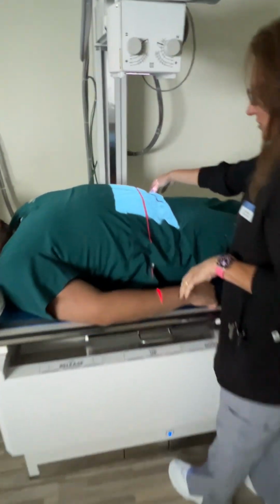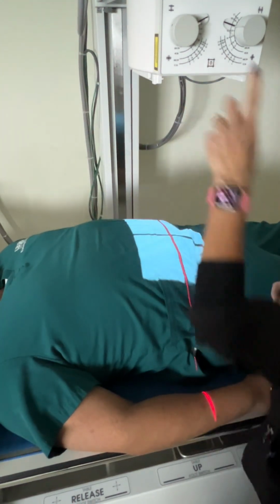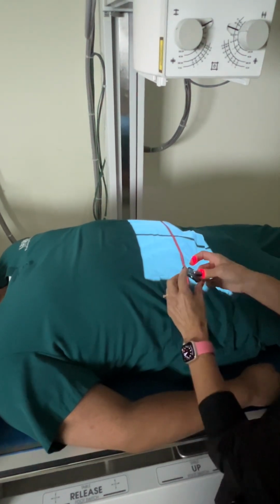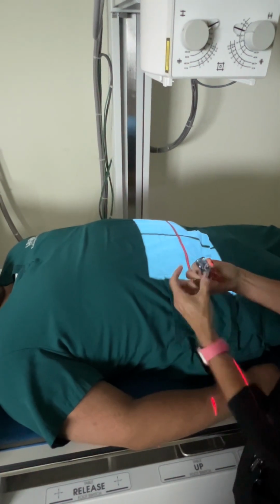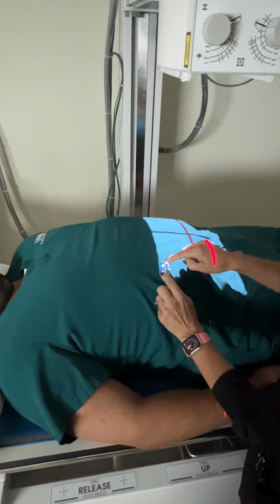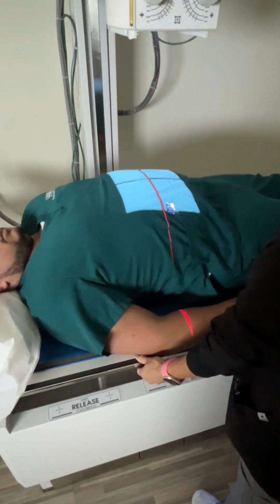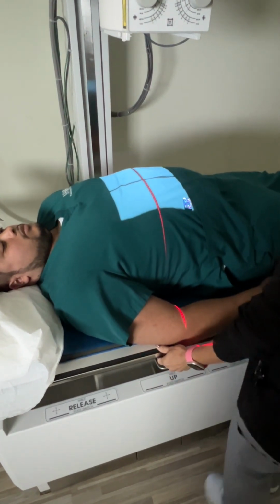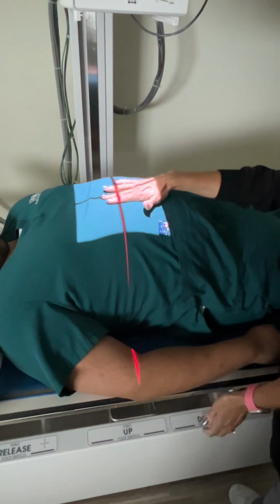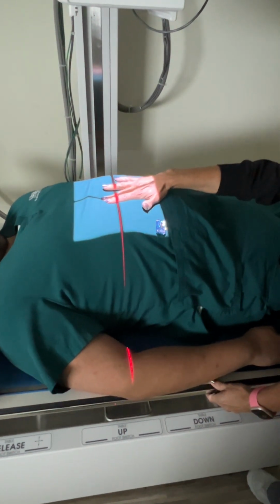So in order to capture the second image, what we do is we have to have overlap. So in order to ensure that I have overlap, what you can do is take your marker or your fingers, either would work. The marker this way is 2 inches, this is 1 inch. So I need at least 1 to 2 inch overlap. So if I put the top of my marker in the light field and I move my patient down so that my marker is in the bottom of the light field, then I know that this area right here is overlapped and it'll be on both images. So that's how I ensure that I have overlap so that the radiologist isn't going to miss anything.